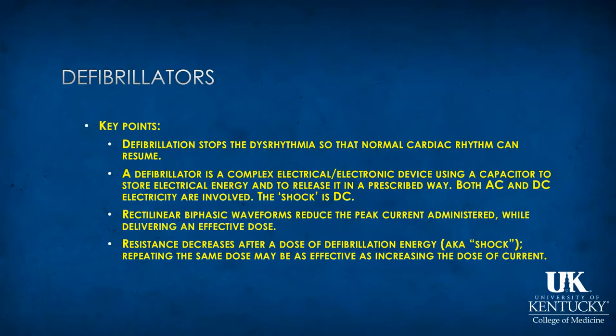A defibrillator is a complex device that uses a capacitor to store electrical energy and to release it in a prescribed way. Both alternating current and direct current are involved. The shock is direct current. The advances in waveforms are such that now a rectilinear biphasic waveform has been created, and it reduces the peak current administered while delivering an effective dose.